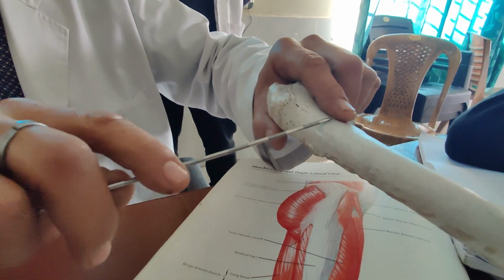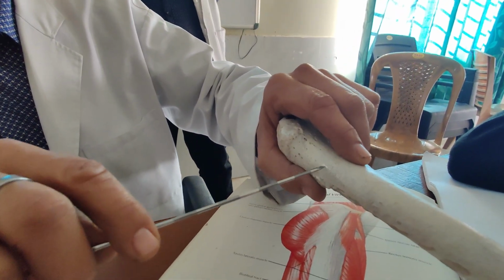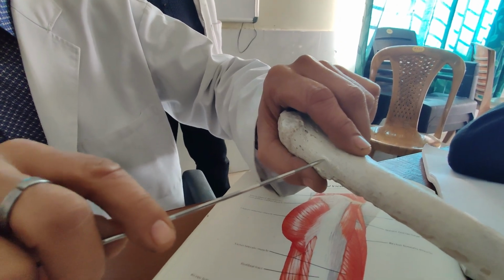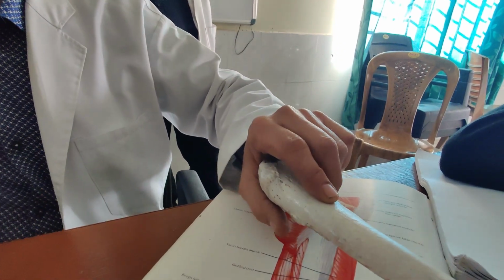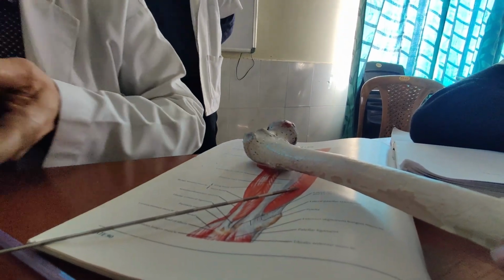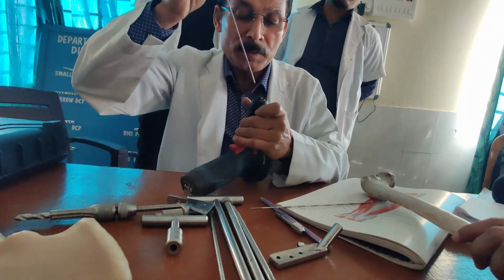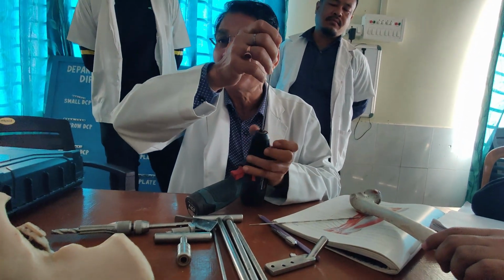You initially do not put the guide wire here. You try to break the wall here with the help of your drill bit. If you try to put the guide wire first, what is the problem you are facing? The guide wire is somewhat malleable.